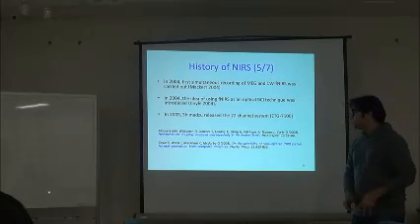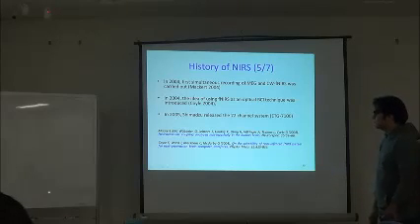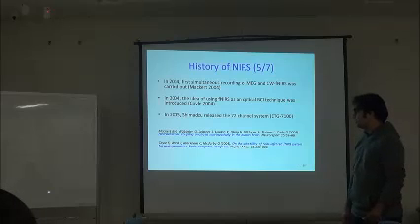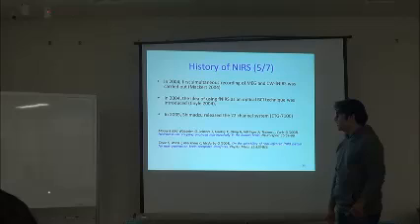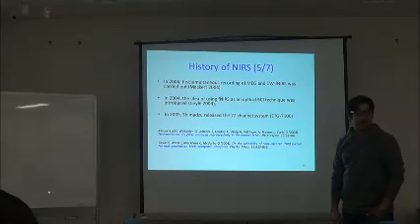Well, this was the first work whose title was on the suitability of near-infrared systems for next generation brain-computer interfaces. In this, they showed that we can actually use the concept of fNIRS for brain-computer interface.